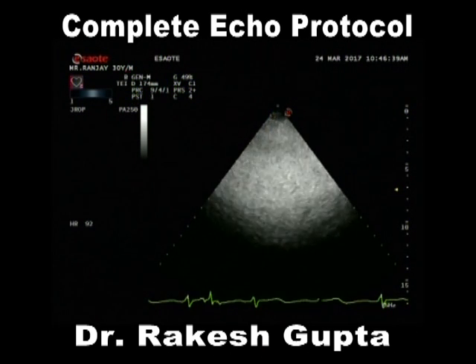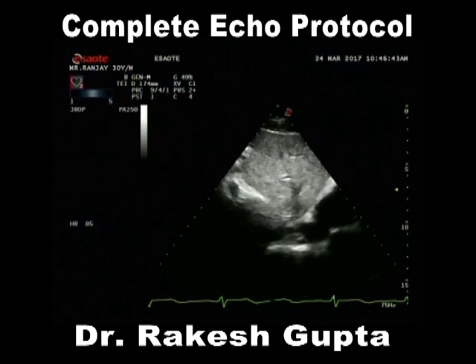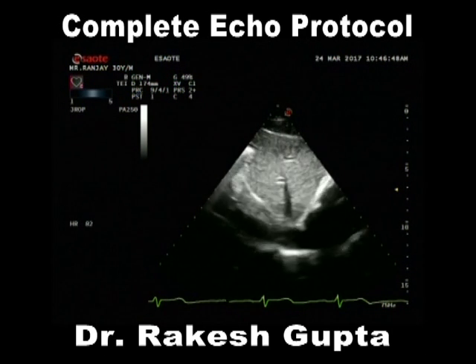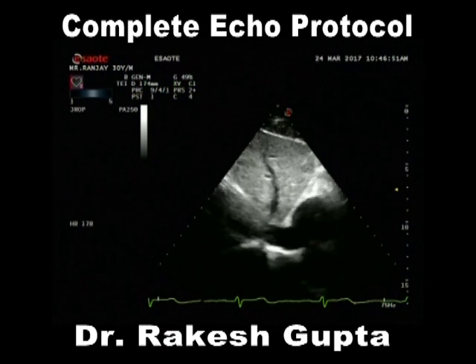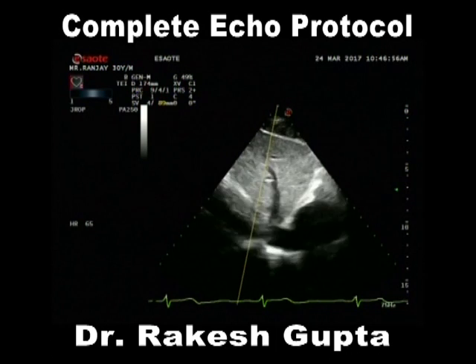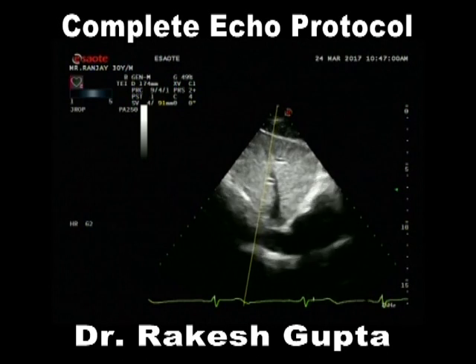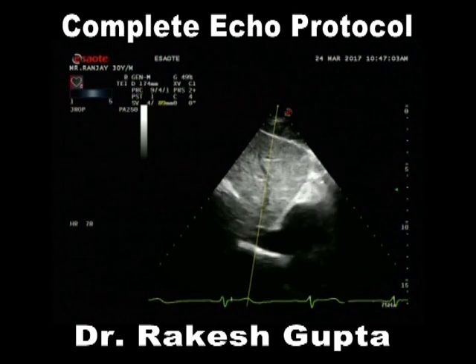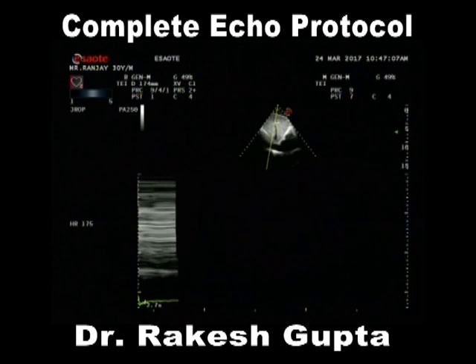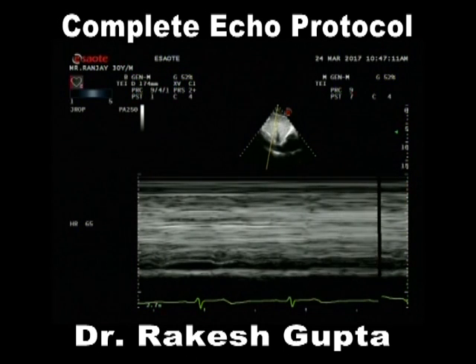Next comes, we should not forget about it. This is a time where we should learn to measure our IVC. It's not that my IVC is this much. Once you start measuring, you realize how bad and how horrible your assessment was when you did not measure your IVC. You have to measure IVC like this in M mode, distal to the hepatic vein drainage, and this is how we always look at measuring the IVC.